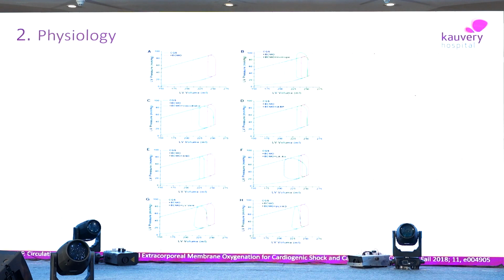There are other ways of doing it, like for example using IABP, but that's almost not done in most settings except in acute myocardial infarction, etc. In the setting of a heart transplant or heart-lung transplant, should this be a particular problem, the usual solutions are to use a surgical vent, which is an LV vent, and splice it to the venous side, or use a temporary device like an Impella.